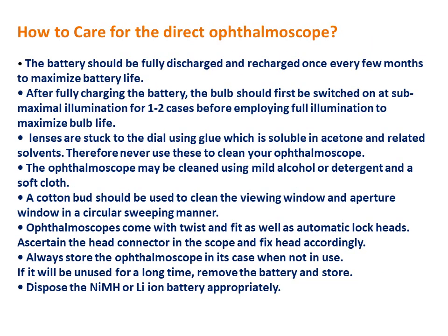Now the ophthalmoscope, as you know very well, is an indispensable equipment. So how to take care of direct ophthalmoscope? You must be able to have a clear and full knowledge of taking care of the direct ophthalmoscope, because it's your responsibility to see to it that it is kept durable rather than getting spoiled much earlier.